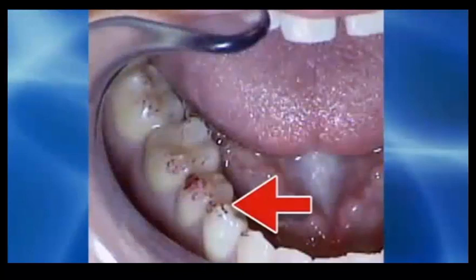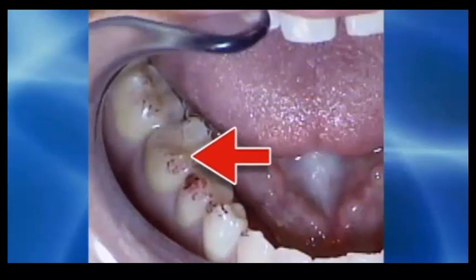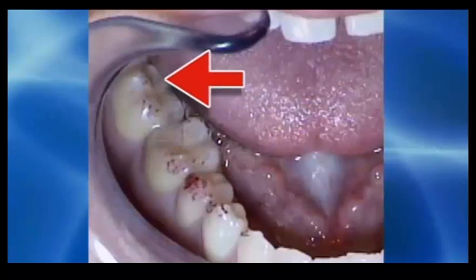She has group function going to the right on this bicuspid, and on this bicuspid, and on this molar. And so these are the contacts that are on the lower teeth that are making up the long disclusion. The most critical one is this one here. It's on the distal buccal incline of the occlusal surface of the second molar.